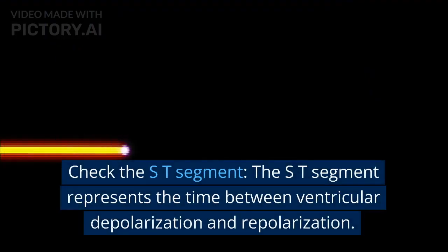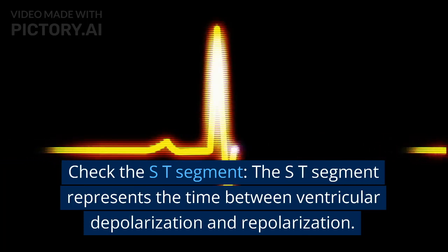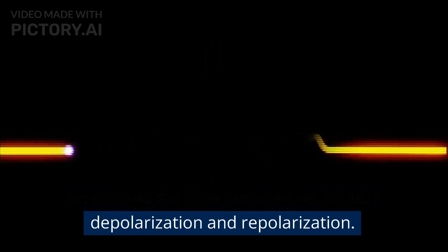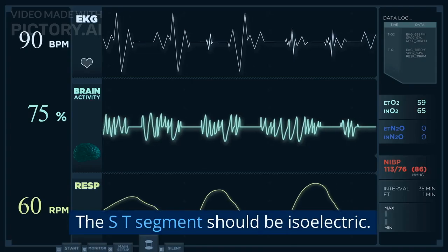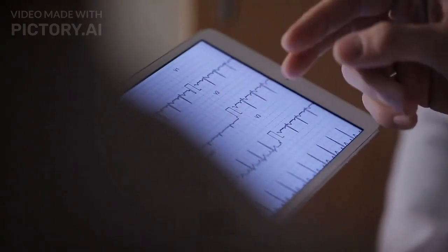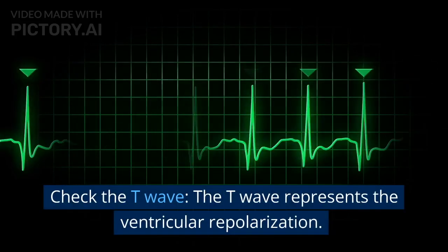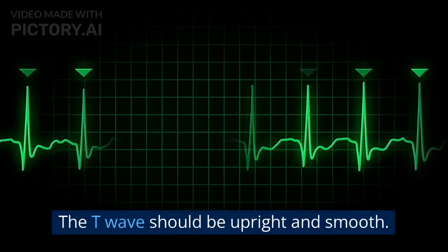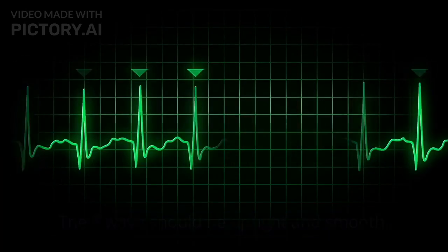9. Check the ST segment. The ST segment represents the time between ventricular depolarization and repolarization. The ST segment should be isoelectric. 10. Check the T wave. The T wave represents the ventricular repolarization. The T wave should be upright and smooth.